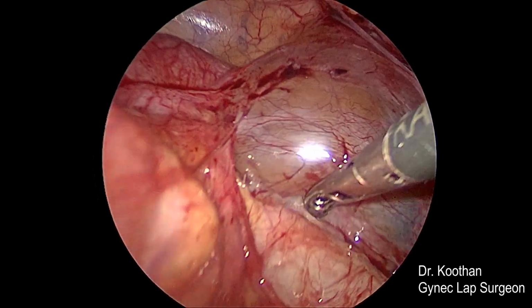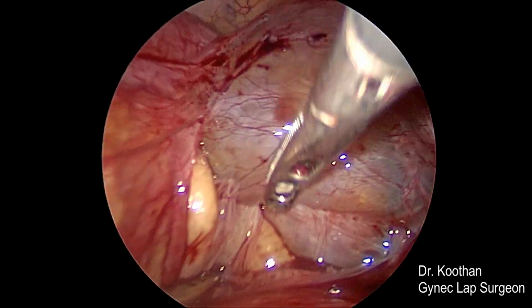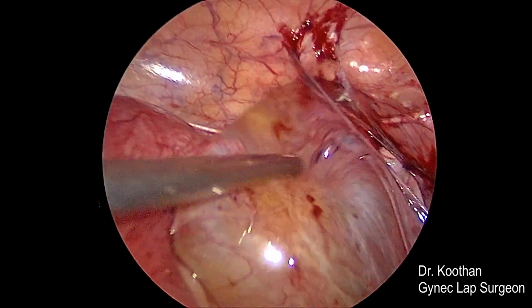This is actually a pelvic inclusion cyst on the right side. So both the sigmoid and the rectum are completely adherent to the uterus and the pelvic inclusion cyst.